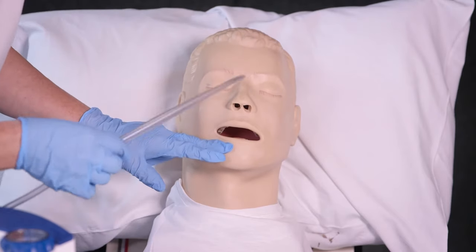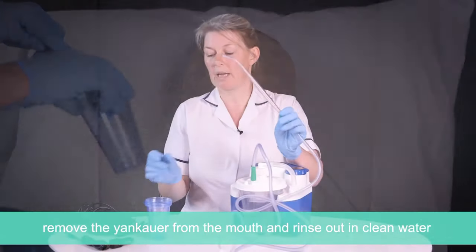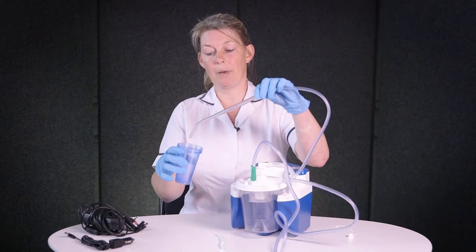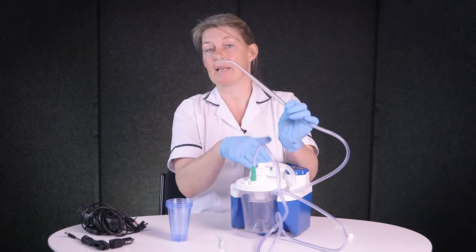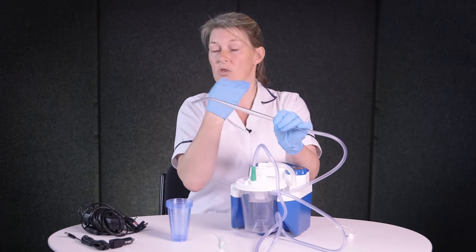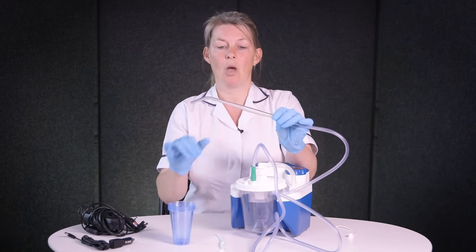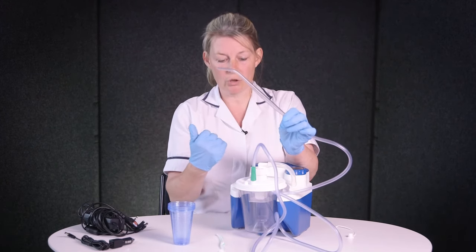Once you've used the Yankauer it's important to clear out the tubing. As soon as you've used it, get a glass of water and — with the machine on — just dip it in and out of the water. That rinses any debris down the tubing and keeps it clear. This isn't sterile because it's just going in your mouth, similar to how a toothbrush would, so a rinse is fine. But if it gets very dirty, just change the tube.